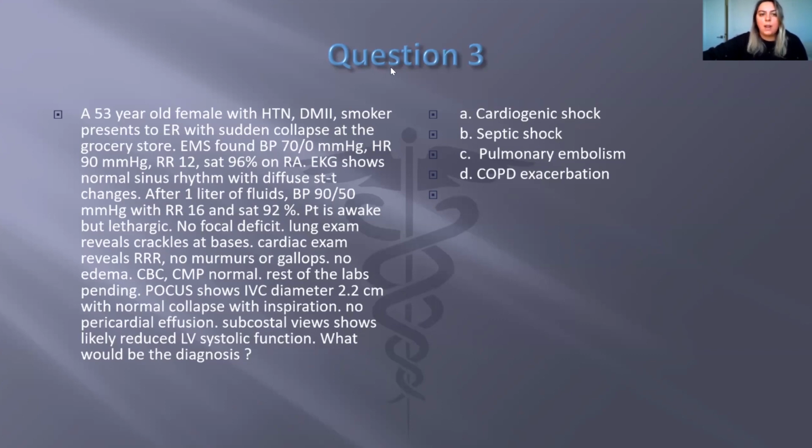Question from Carlos. I have been using the mitral valve EPSS as a way to grossly identify LV function. Should we use short axis parasternal view as more accurate to determine LV function in shock state? So EPSS is a good way of knowing if EF is low in parasternal long axis.